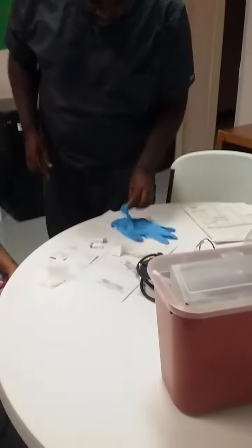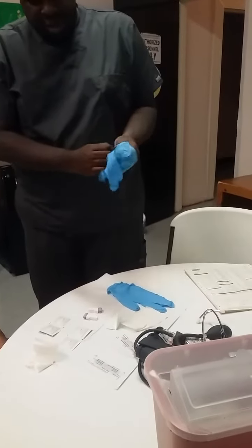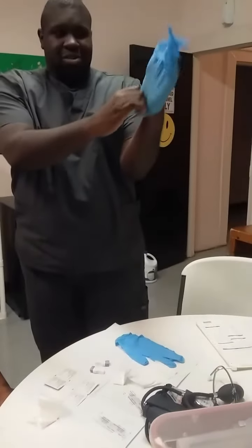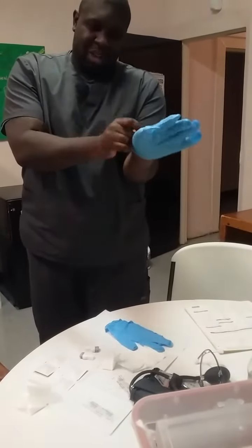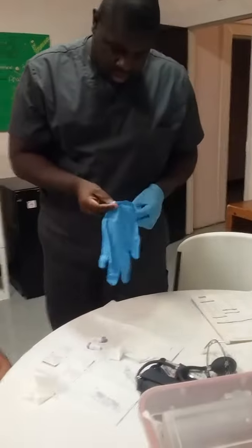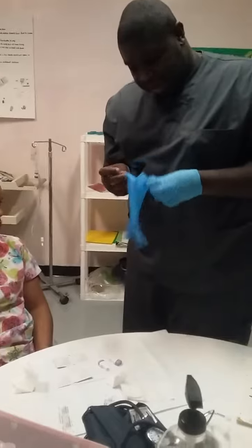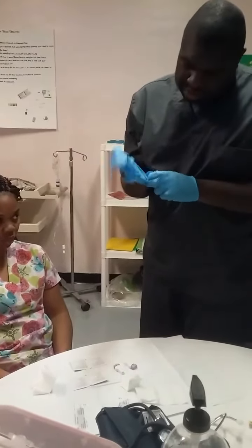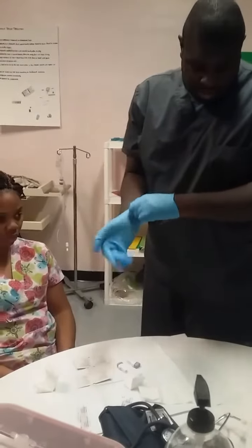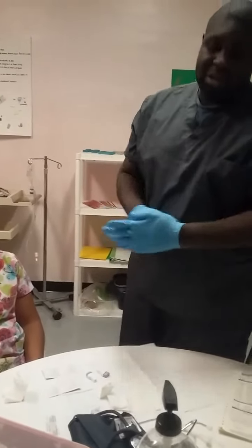After we've done that, it's time to don our gloves. You can do it either way. You can do left hand first or right hand first. Since I'm right-handed, I'm gonna put my left hand glove on first. But like I said, it really doesn't matter. Don them. Being a little difficult. Put these on here. Okay. Got our gloves on.